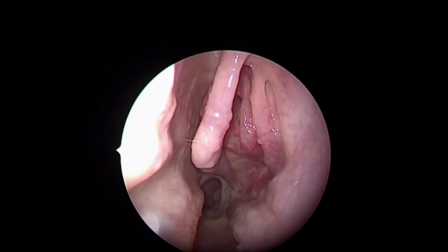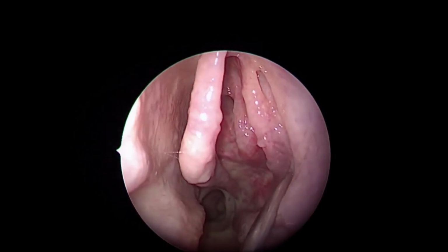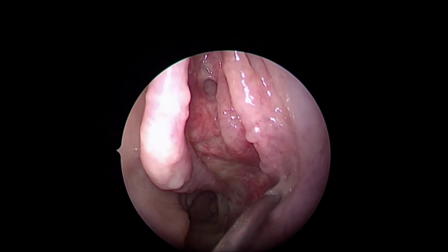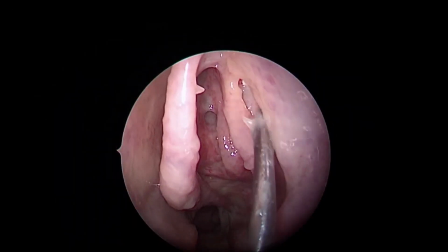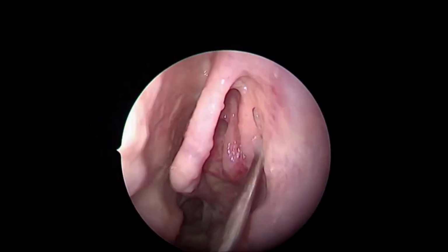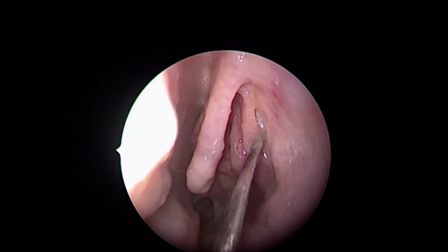When this surgery burst onto the scene in the 70s, the uncinectomy would be done using a sickle knife all along its attachment to the lateral nasal wall, all the way to the horizontal segment. This used to be a popular step to begin with. But the only concern to me, which a lot of people still do, is that I will show exactly once I remove this, how close the upper part of the uncinate is to the lateral nasal wall. Sometimes when it is too close, and if you are not careful, you can get an accidental entry into the orbit.